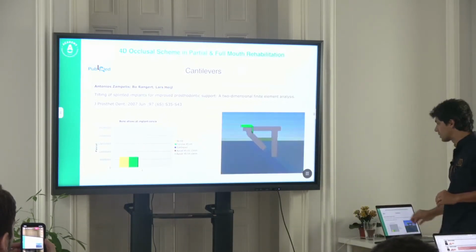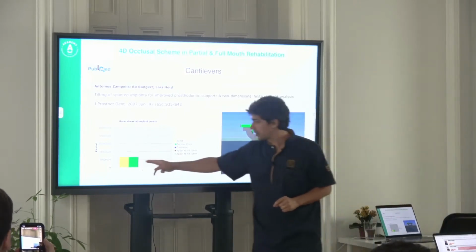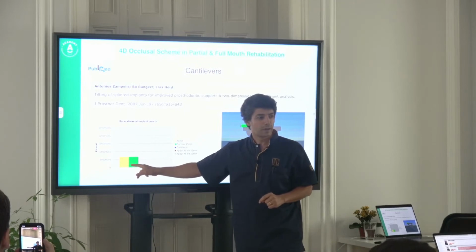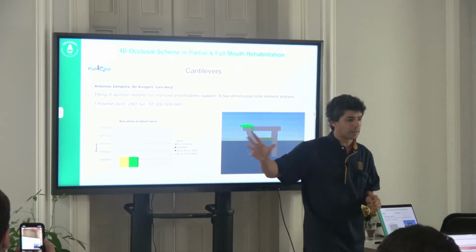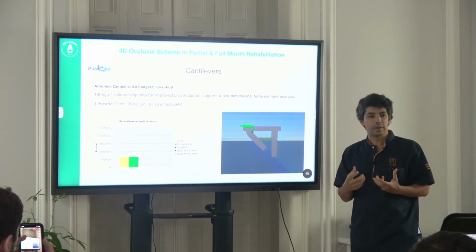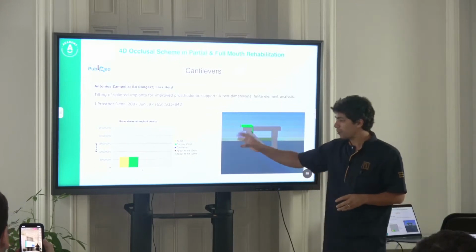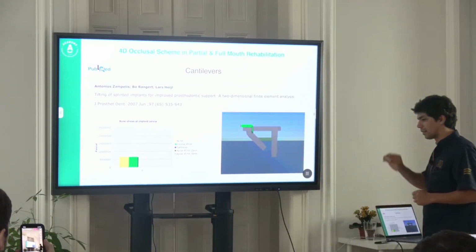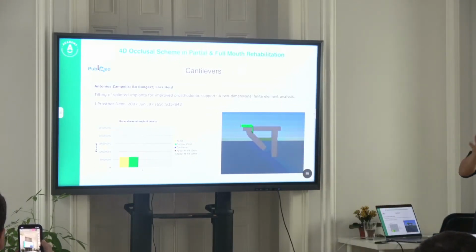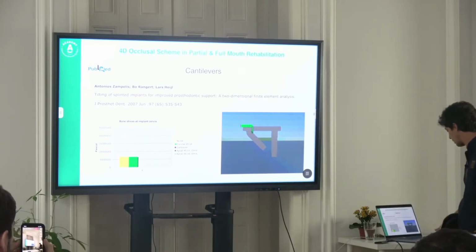As we tilt the implants in the same length of framework, as you can see, there's no statistical evidence or difference that could be stated as really important. What for me is really the point that I want you guys to bear in mind as an image is this one.